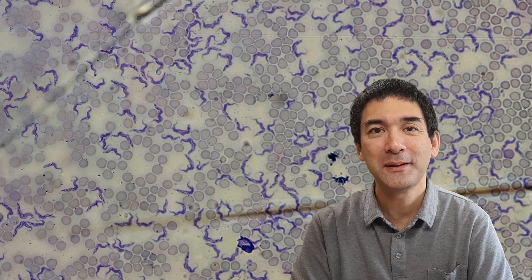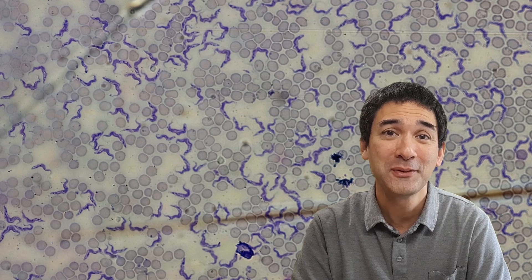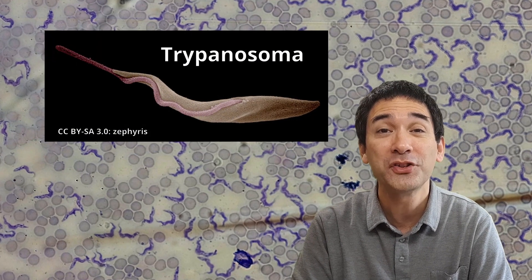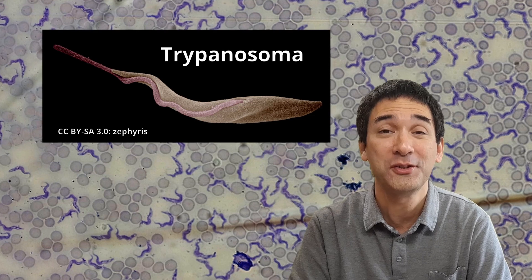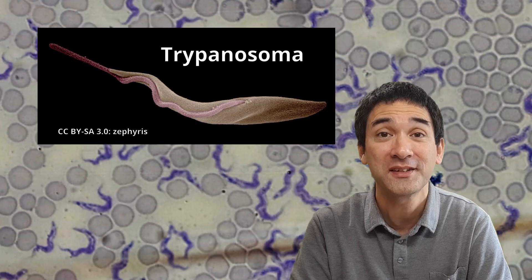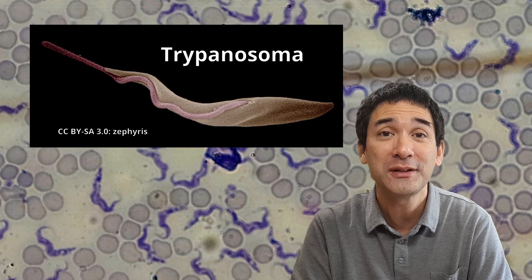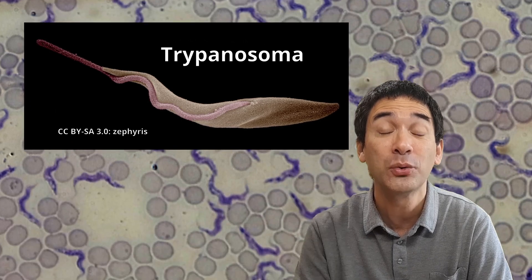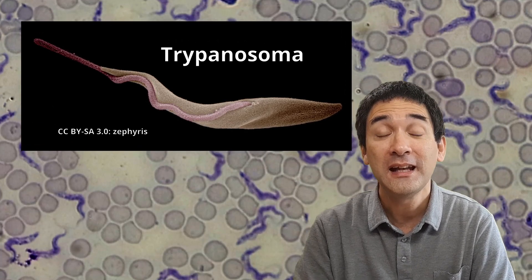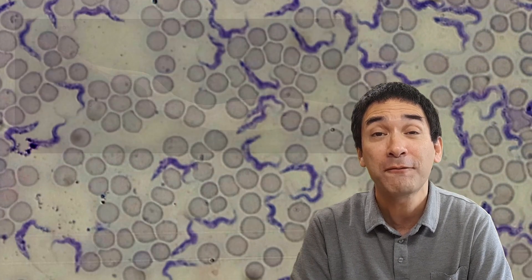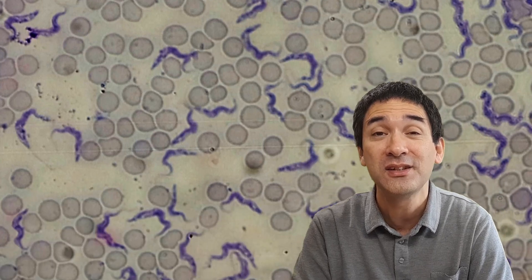This is blood under the microscope, and you might notice something unusual — those bluish squiggly lines. These are known as trypanosomas, and trypanosomas are parasites. They're protozoans that reproduce inside the blood of humans and animals who are infected, and they cause African sleeping sickness, a disease which you don't want to get.